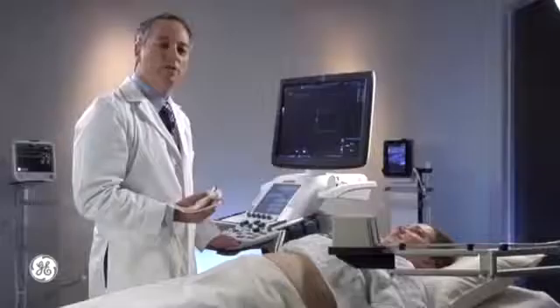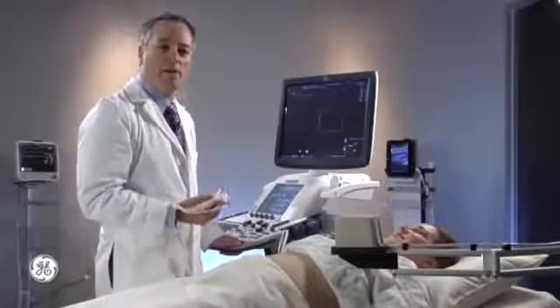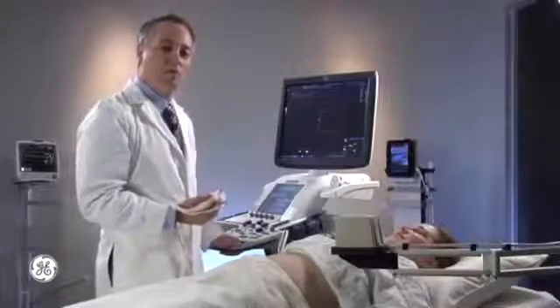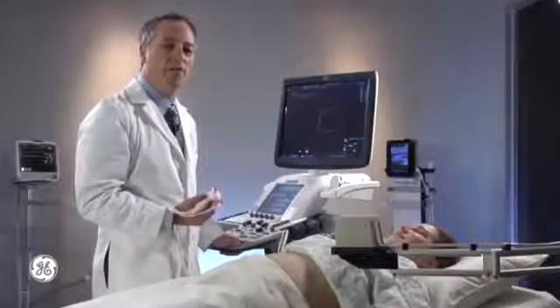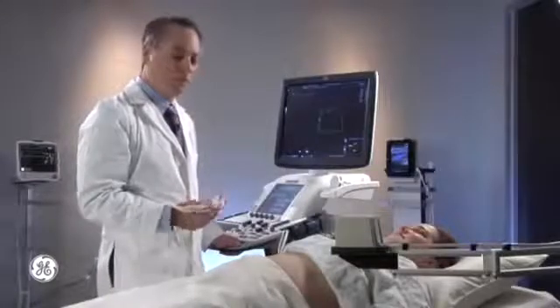GPS can be a helpful tool that's part of the volume navigation suite. GPS markers allows me to mark a specific area in my previously acquired CT or MR, and the system will automatically show me the corresponding location in my live ultrasound. There's several different ways that you can use GPS markers, and I'll demonstrate them all for you.